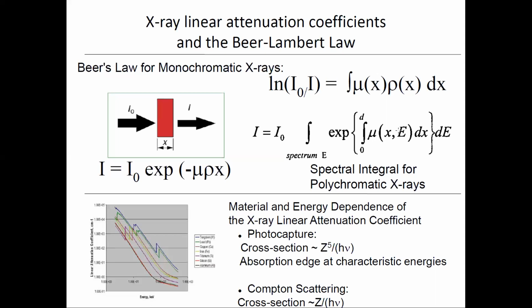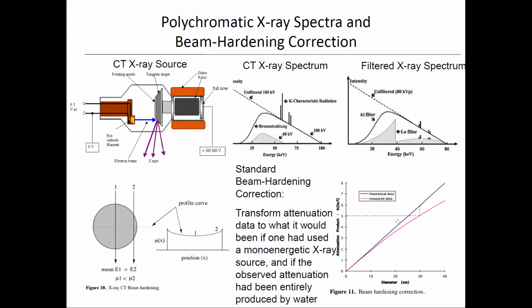So spectral component by spectral component, you've got a very nice setup, but you end up having to have this approximation where you treat it as close to being monoenergetic. What's the average energy? And then you make this thing called the beam hardening correction, which is an approximation. So we have, as usual with analytic reconstruction, with this brute force inverting to first order on everything, it's going to then have artifacts. In this case, a beam hardening artifact, and it's going to have issues with quantitative accuracy. So you find that you can get around those things with model-based, as we'll come to in a moment.